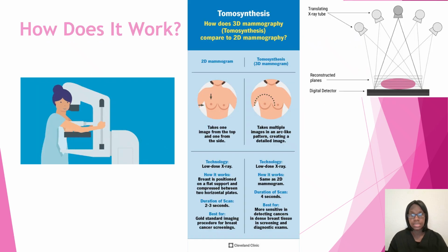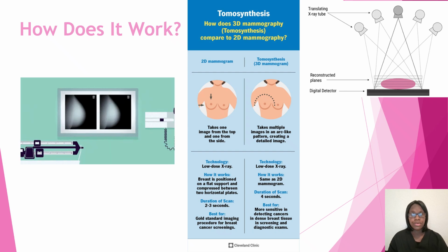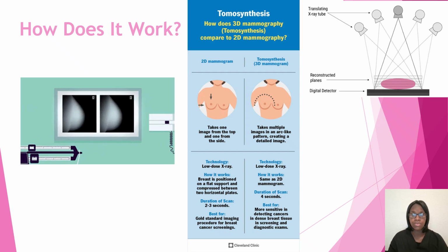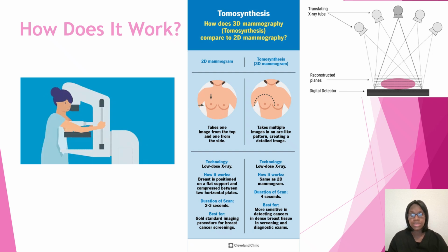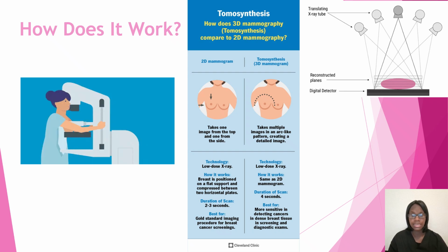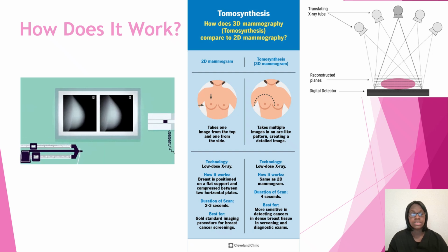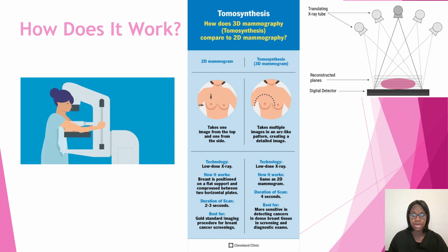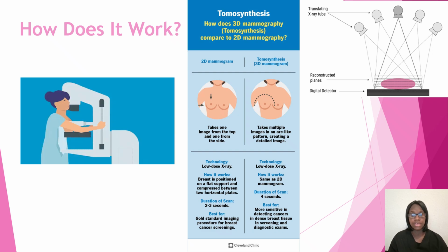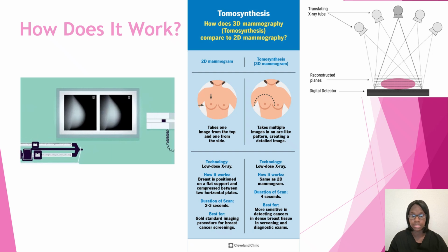So how does it work? We'll do the overview. This is from the Cleveland Clinic, where I got this information. With tomosynthesis, we'll start with the 2D mammogram. With the 2D mammogram, it takes one image from the top and one from the side, using low dose X-ray. The breast is positioned on the detector, and whenever you have the breast in compression on the plate, you'll take the exposure.